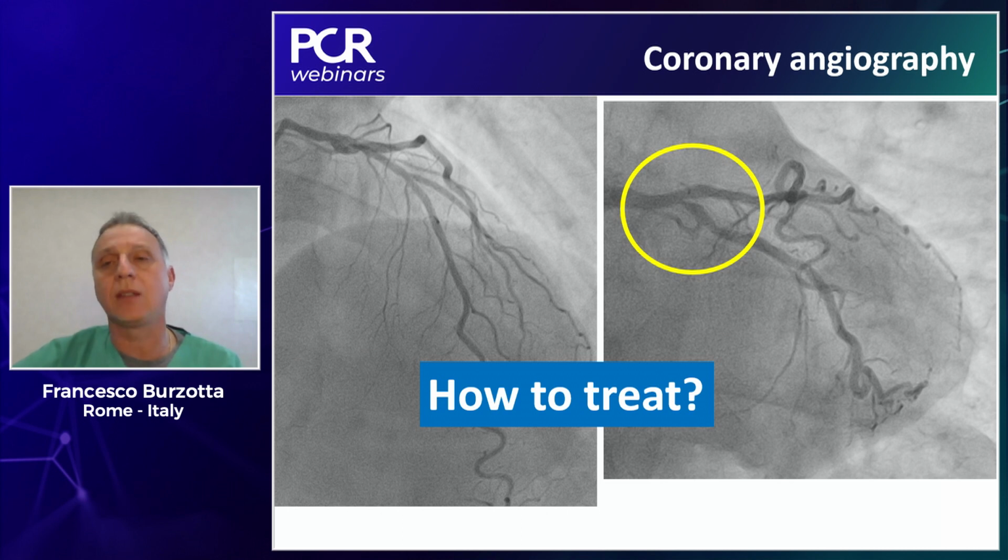We should appropriately select the stent, and appropriately manipulate the stent with ballooning techniques, and we will probably review this during this case. We started with the first case. Moving forward, I have to say that we didn't mention medical therapy. In my practice, I often decide not to treat some ostial circumflex lesions if the patient is stable, or if the patient is old. I mean, I'm not expected to put in a lot of effort testing the possibility of ischemia. And in cases of doubt, that is really the condition in which we like to assess the need for intervention with functional evaluation. However, in this case, the patient had a positive stress test, was symptomatic, and was very active.